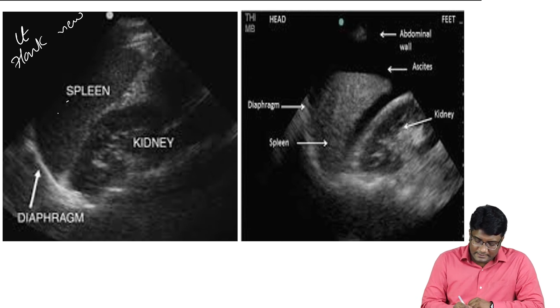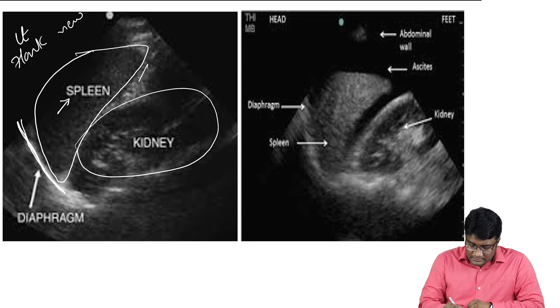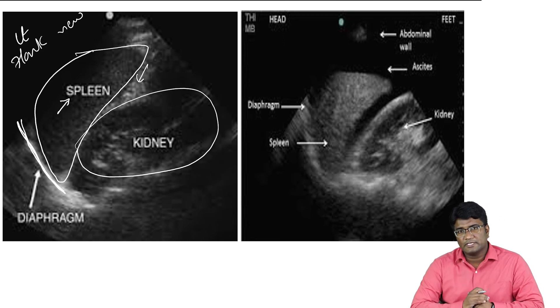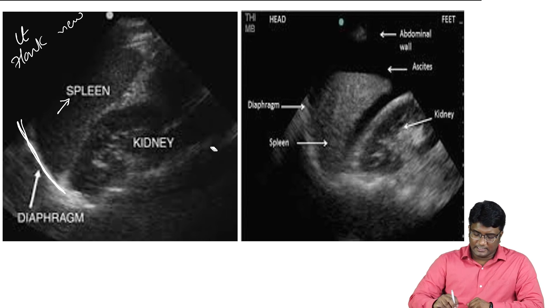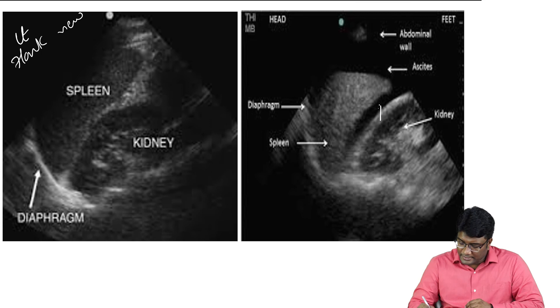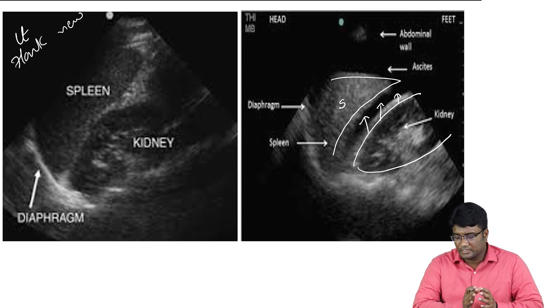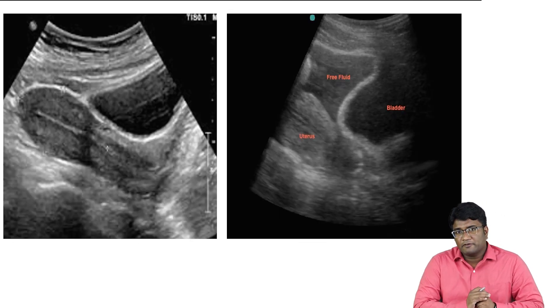On the left flank view, you can see the spleen, the diaphragm as a white area, and the kidney. In a normal view, you see normal fat around the kidney with no collection. In a positive finding, there is a hypoechoic collection around the spleen — perisplenic collection — again indicating FAST positive.